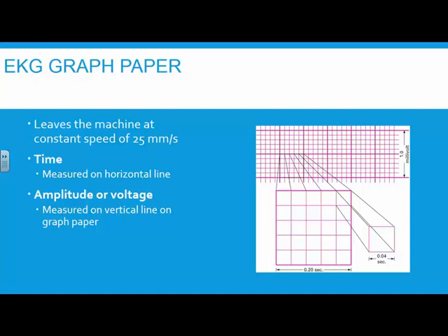Very important. Understanding how this graph paper works without anything on it will be quintessential for you to understand this graph paper when you get all the squiggly lines on it. Okay?